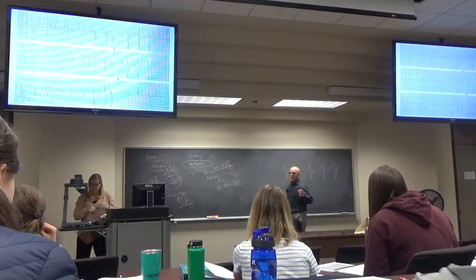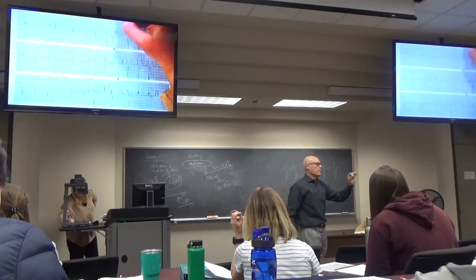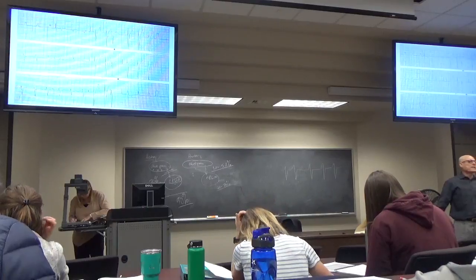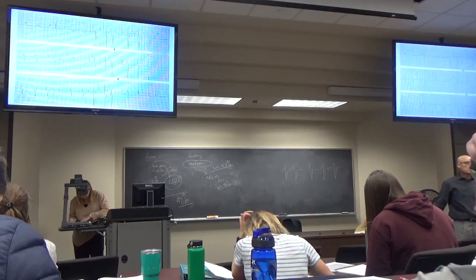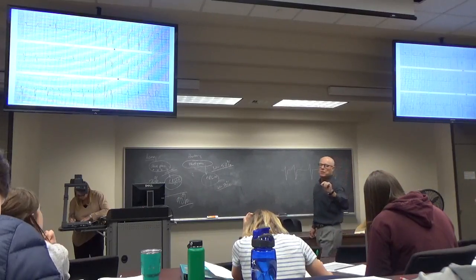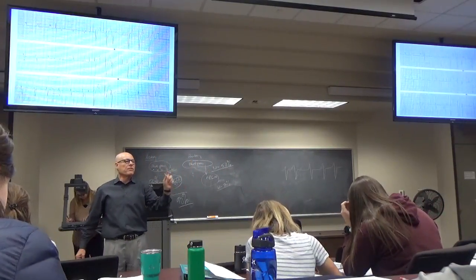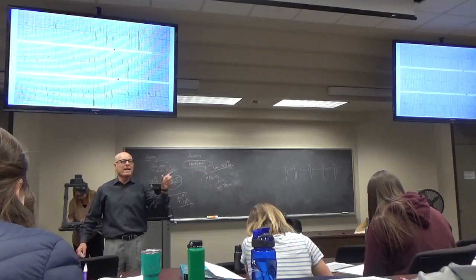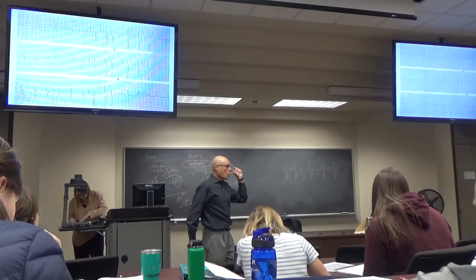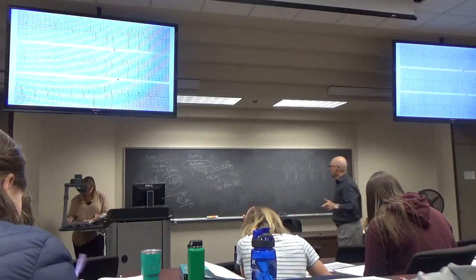Okay, so let's try to figure out what defines a PVC, premature ventricular contraction. The term implies that the electricity is coming from the ventricle, not from the AV node, not from the sinus node. It's coming from the ventricle. So what will the QRS look like? It'll be too wide. If the pacemaker is in the ventricle, the QRS has to be wide. So PVC means it's wide, and what else? Premature. It's coming too early.